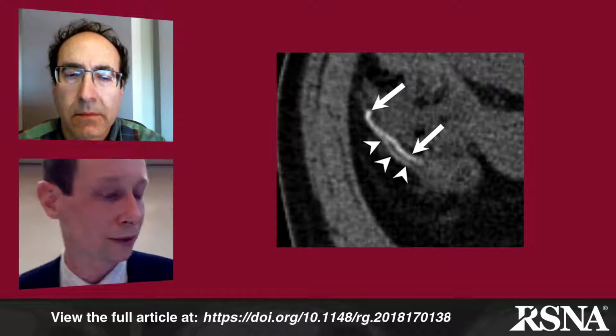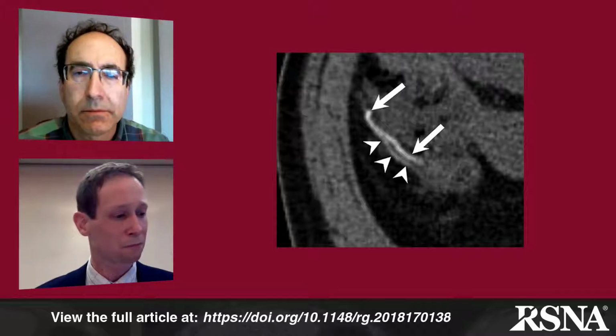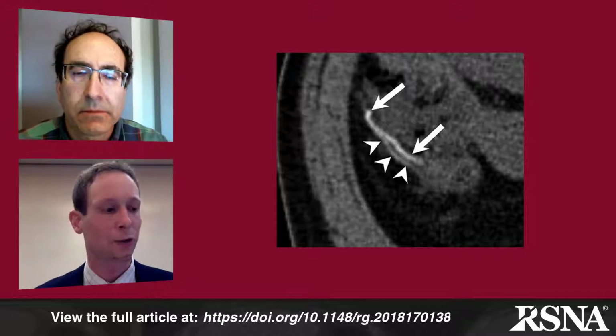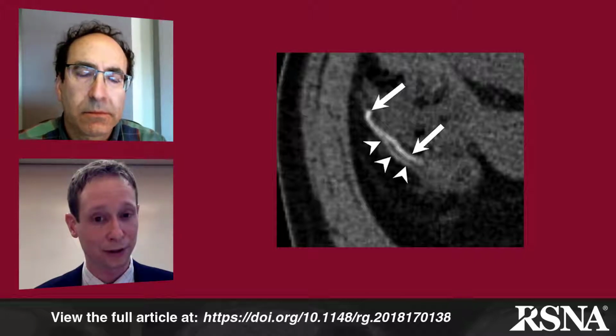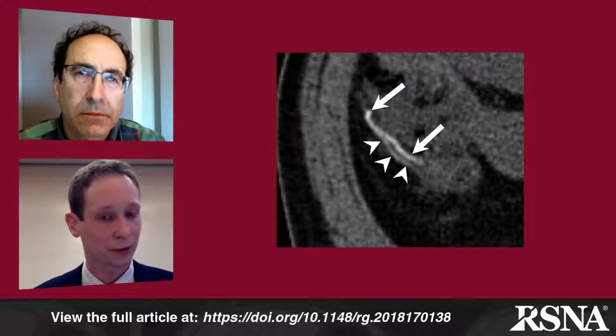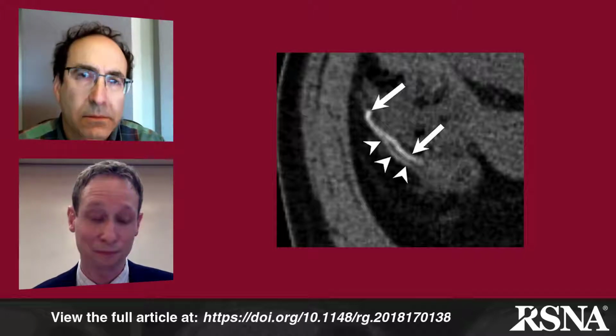And so when we look at this figure, the arrowheads are indicating the feeding artery, and the solid arrows are indicating the vein. And you'll notice that in the arterial phase, the vein is actually a little brighter than the adjacent artery, and it's relatively dilated, which are both characteristic findings in an early draining vein.